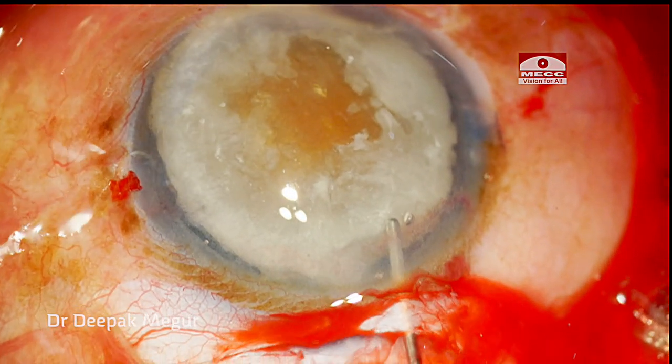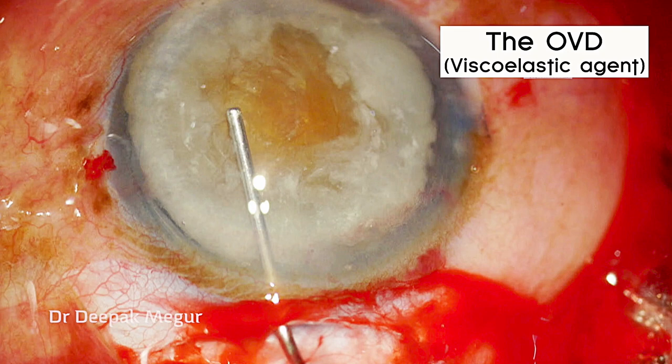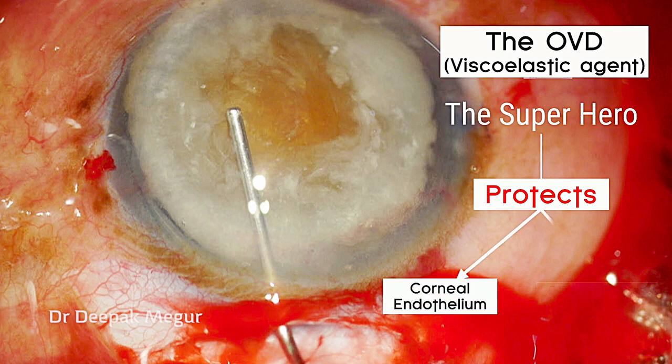OVD is being injected around the nucleus — both below and above it. The OVD is our superhero: it protects the endothelium and also other structures like the iris and the capsule bag.